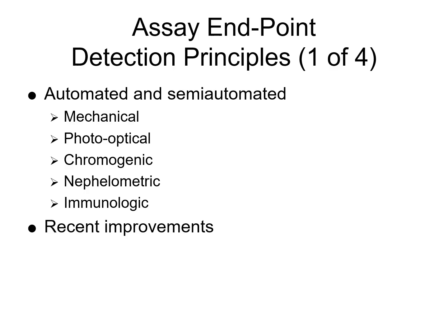For recent improvements, there are enhanced automation and integration with laboratory information systems. We have improved sensitivity and specificity through refined reagents and detection methods. We also have miniaturization and point-of-care testing devices for rapid bedside results. We use multiplex assays that allow simultaneous measurement of multiple analytes.